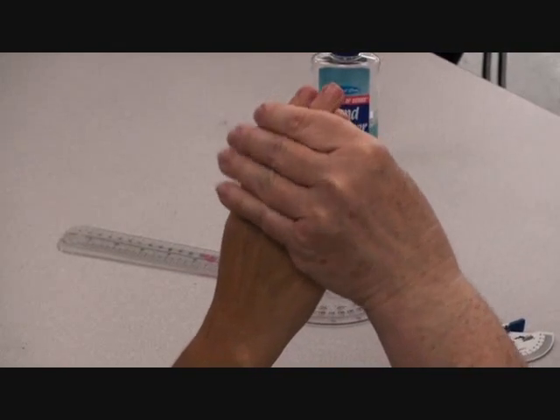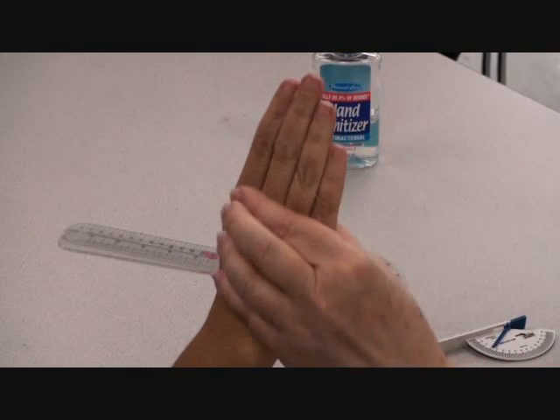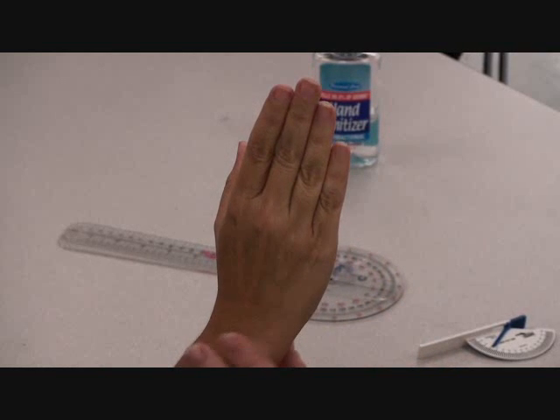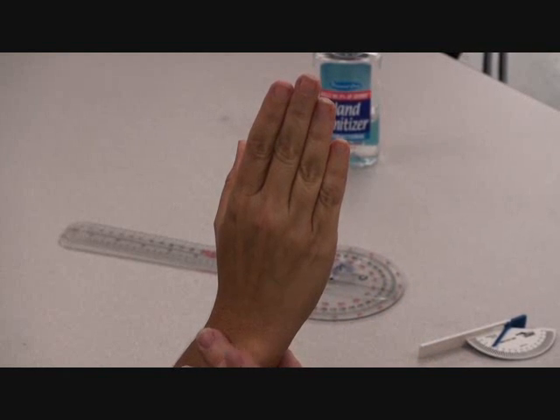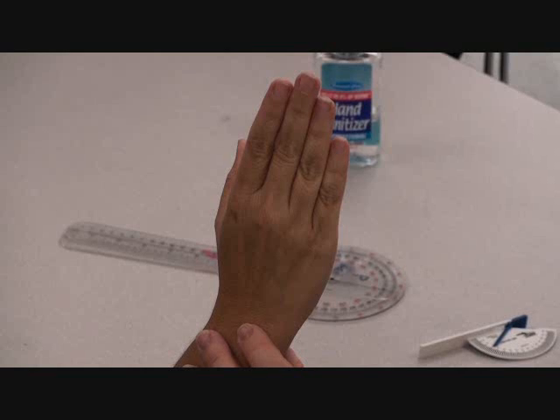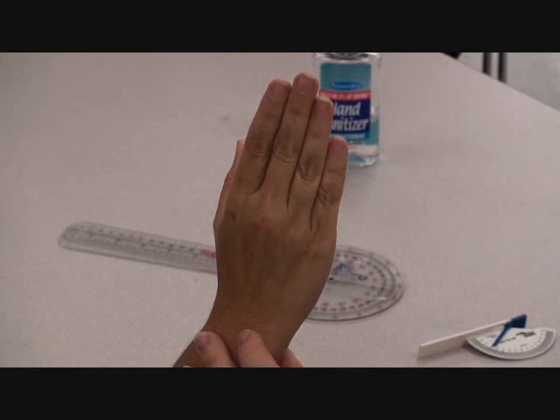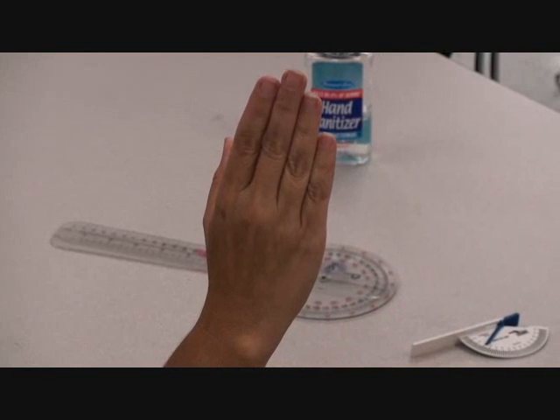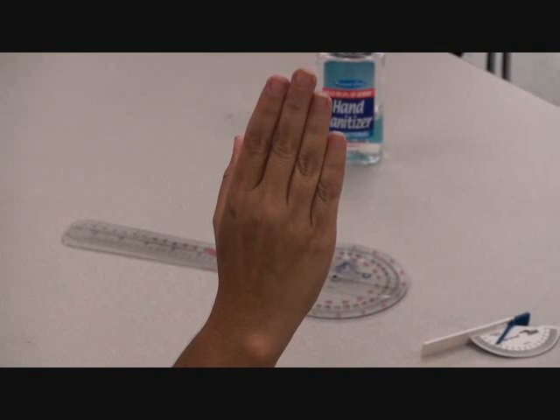But clearly she can extend to neutral, right? So in this case, I would probably just put zeros, and I would note in my narrative that the patient could extend at all joints to zero, and in fact demonstrated some hypermobility, actually she could hyperextend, which was most notable at the MPs and IPs.